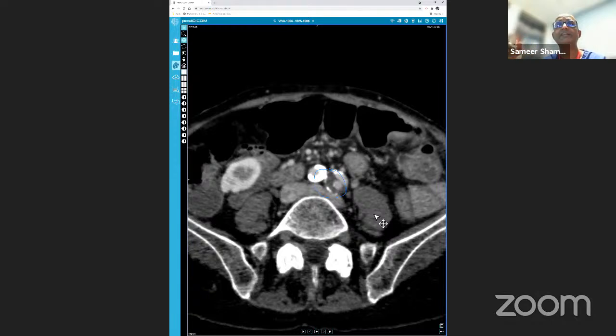Okay, and then look for metastasis. You do that process and then you say that this is looking very benign. I wouldn't touch this lesion. I would always compare it with the previous film to see if it has changed in size or any characteristics, and then move on to the next finding.